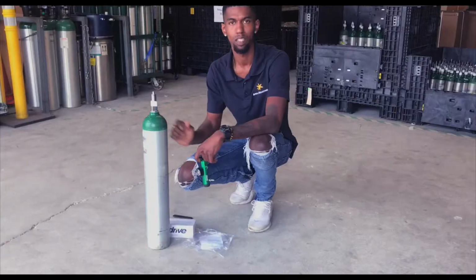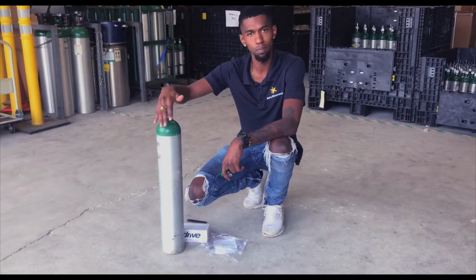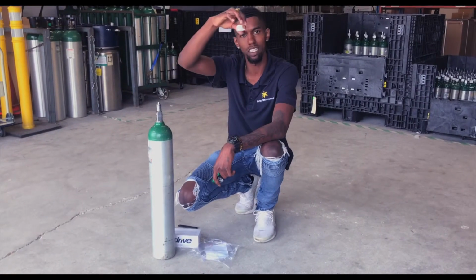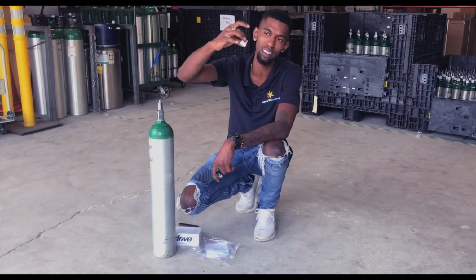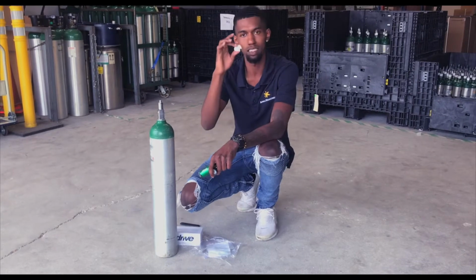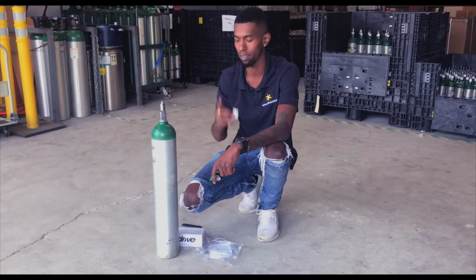you want to go. Alright guys, first things first, if your technician has already brought you a tank, 9 times out of 10 it has a white piece of tape on it indicating that the tank is full. So you can either take this tape off, you can keep it on, it doesn't really matter to me, but basically what this white tape means is that you have a full oxygen tank.